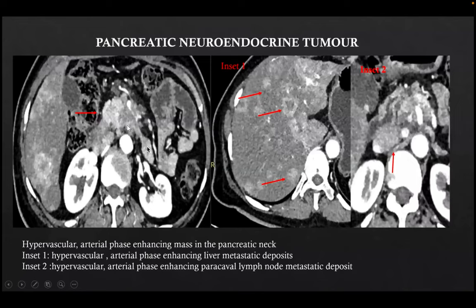This was a case of pancreatic neuroendocrine tumor. We can see a hypervascular enhancing mass in the arterial phase in the neck of the pancreas. In insert 1, we can see hypervascular enhancing liver metastatic deposits in the arterial phase, and in insert 2, we can see hypervascular arterial-phase enhancing paracaval lymph nodes.